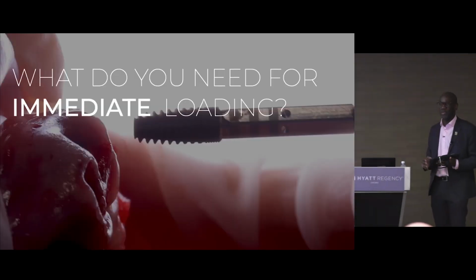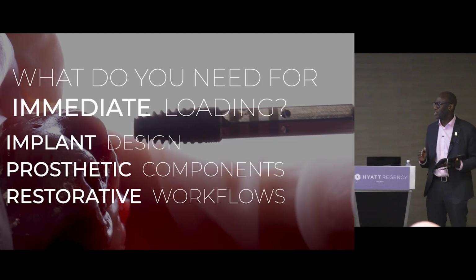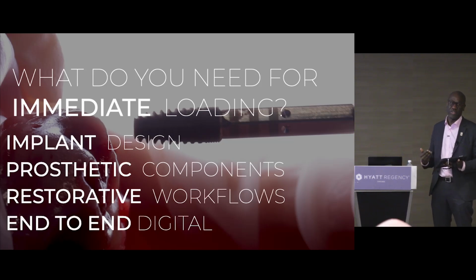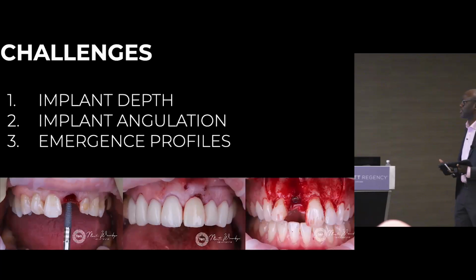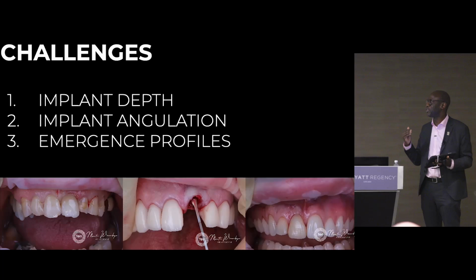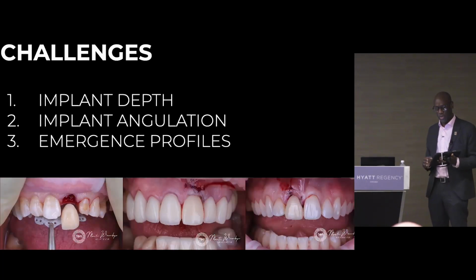So we know that when we do immediate loading, from the clinical perspective, we know that the implant design is important, the prosthetic components are important, and restorative workflows, but really it's those parts we're talking about, the prosthetic components, the restorative workflows, and the end-to-end digital is what we're going to talk through. So what are my challenges, and what itch does this scratch? Basically, we have an issue when we place implants. The implants are deep when we place them immediately. We also sometimes have to place them with angulated screw access, which sometimes can be difficult. We also have to manage the emergence profiles when we do this.